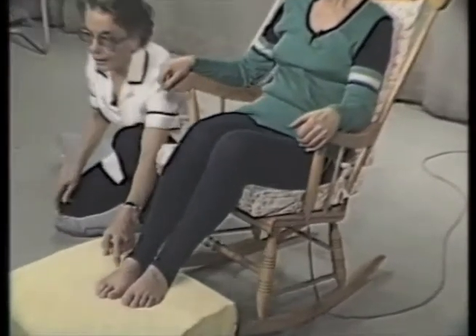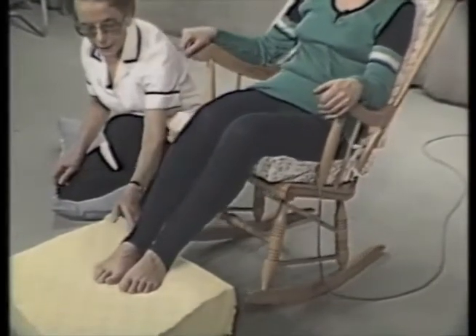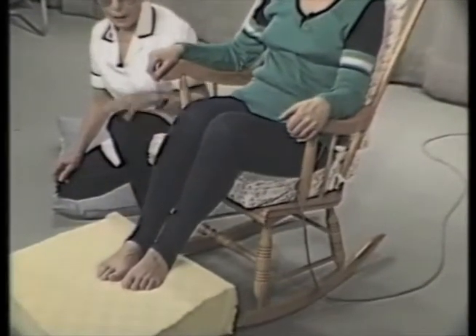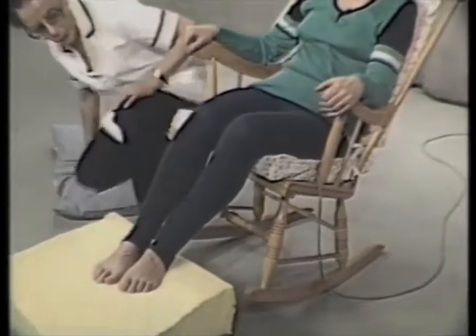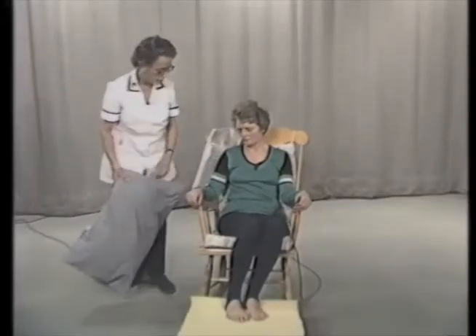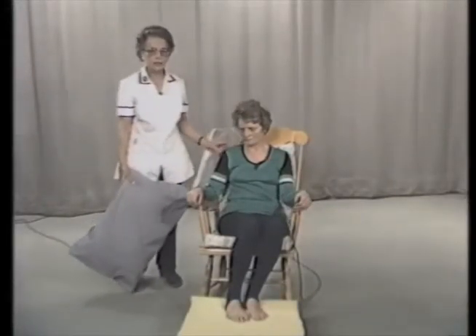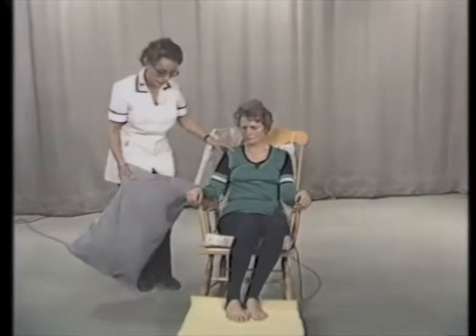There is a very nice leg pattern, and she's weight-bearing on the heel and doing very good therapeutic exercise for the leg. But what about the arm while she's doing that? This is our chance to show you how to put on an arm splint with the patient in sitting. But first I should say it is best to apply the splint with the patient in lying, as already described.